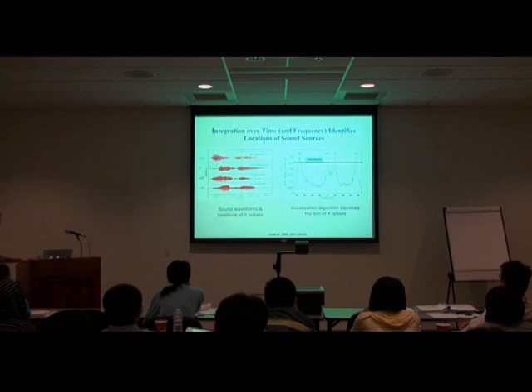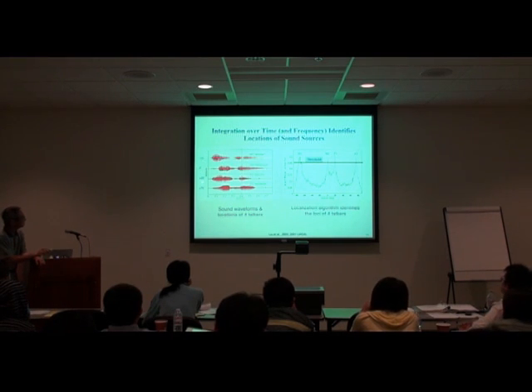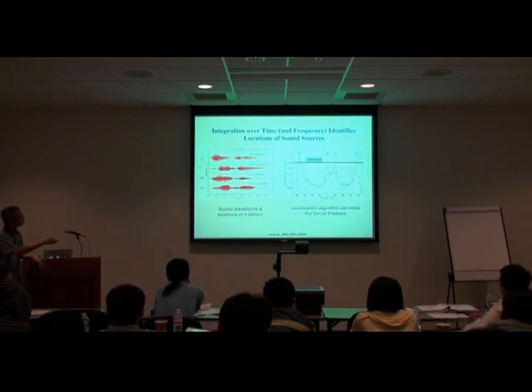What happens then when you have multiple sources? Let's say there are 4 talkers talking at 4 different locations: -75 degrees, 0 degrees, +20, and +75 degrees. And they have different words. One is saying armchair, playground, pancake, woodwork, and we can look at different times and see these emerging patterns coming in and out, in and out, all the time. So the sound wave is complicated, but from the localization algorithm, you can identify the absolute locations of the 4 talkers, here at -75, 0, 20, and 75.